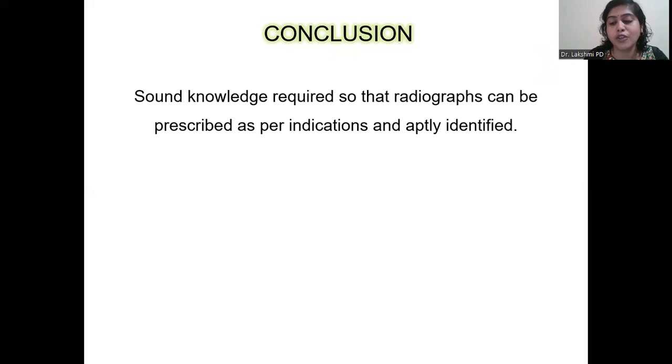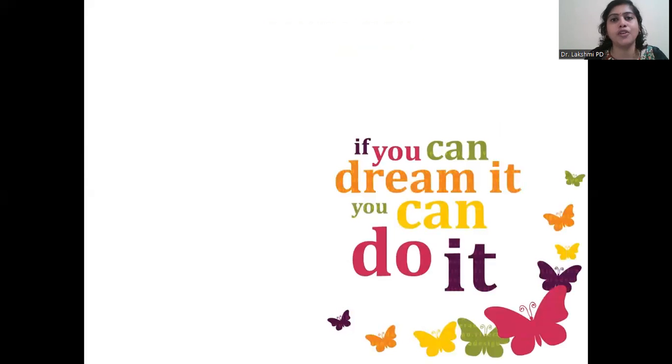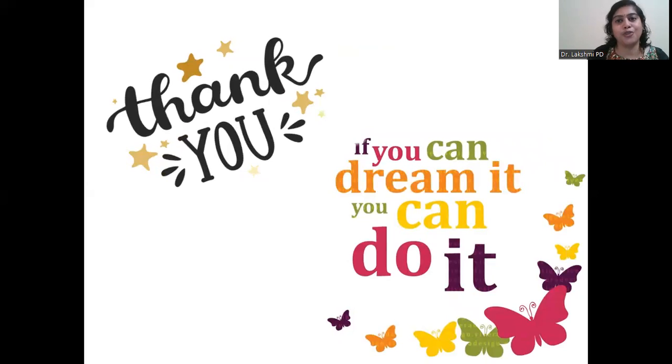And also by the knowledge about the various composition of the various layers and how thin and delicate they are, you will learn how to gently handle these films and to prevent any sort of rough handling, to prevent any sort of damage to your radiographic images. So I hope I'm very clear, and this provides your basic knowledge about the parts and composition of your X-ray film. Thank you for your patient listening.